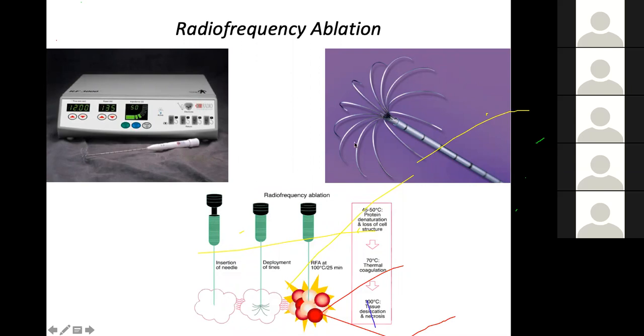So if you see a needle like this, it is a starburst needle of radiofrequency ablation. If you do not have a burst of stylets coming out like this, and you only have a needle with 2 marks like this, then it's a radiofrequency ablation needle. Unlikely to be shown. If at all shown, you would be shown something like this because this is rather distinctive.